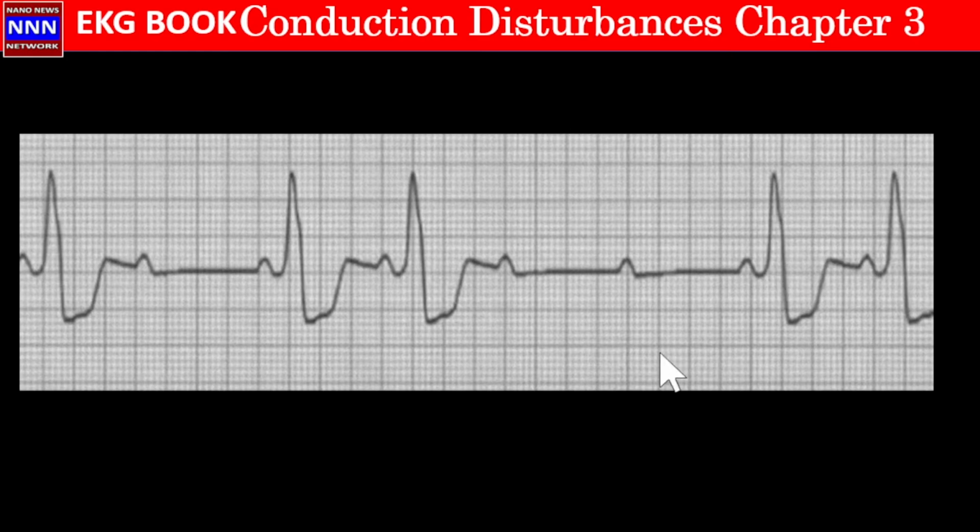This is a pretty abnormal electrocardiogram. Here we have the P, P, P, P, P, P, P. They are constantly marching. The PR intervals are marching, and we have PR intervals which vary here, but then we have several P waves blocked. In a Wenckebach block, if this is Wenckebach block, you would expect only one P wave to be dropped following progressive prolongation of the PR interval.